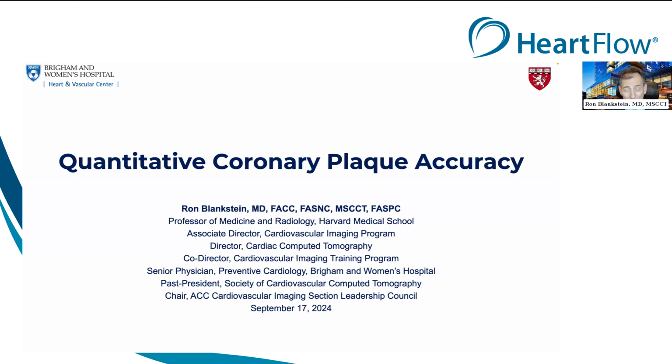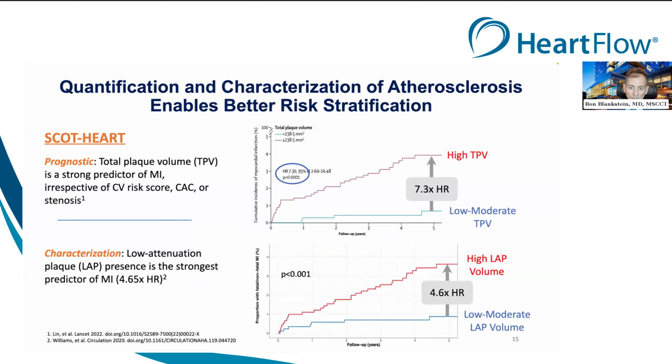Well, Jonathan, thank you for the very kind introduction, and always an honor to follow you and follow an outstanding talk. I'm going to talk more about plaque analysis. We'll shift a little bit to plaque analysis. And one of the really exciting developments in plaque analysis is what we now call quantitative coronary plaque analysis, or QCPA. And I'll talk about the accuracy of that, and I'll show you an example.